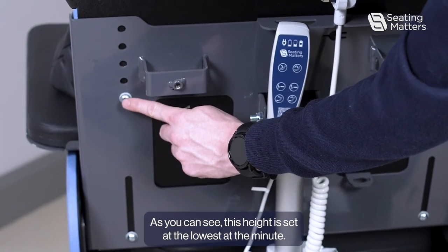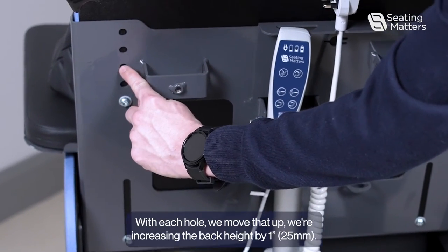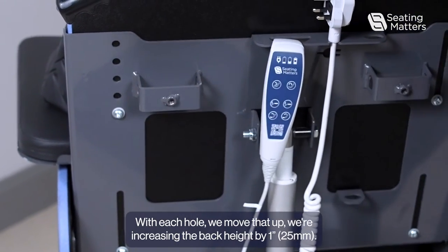As you can see, this height is set at the lowest at the minute. With each hole we move it up, we're increasing the back height by one inch.